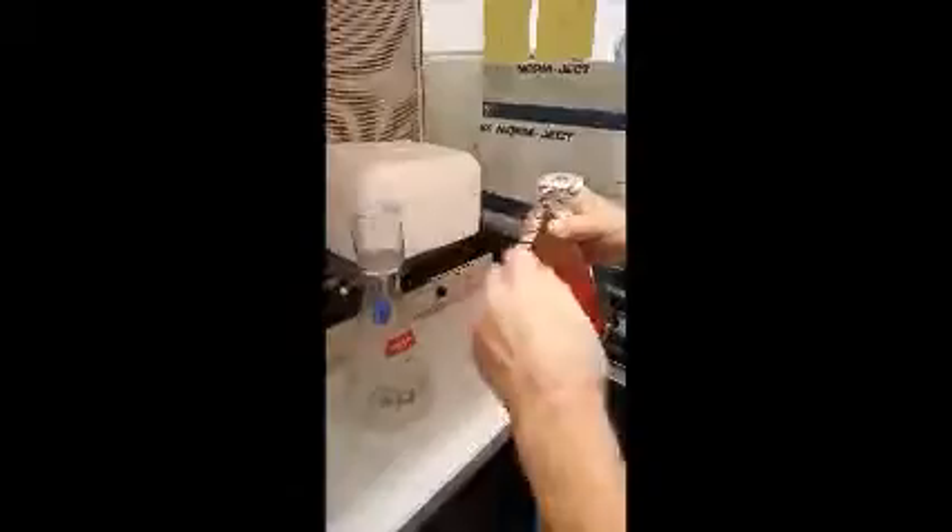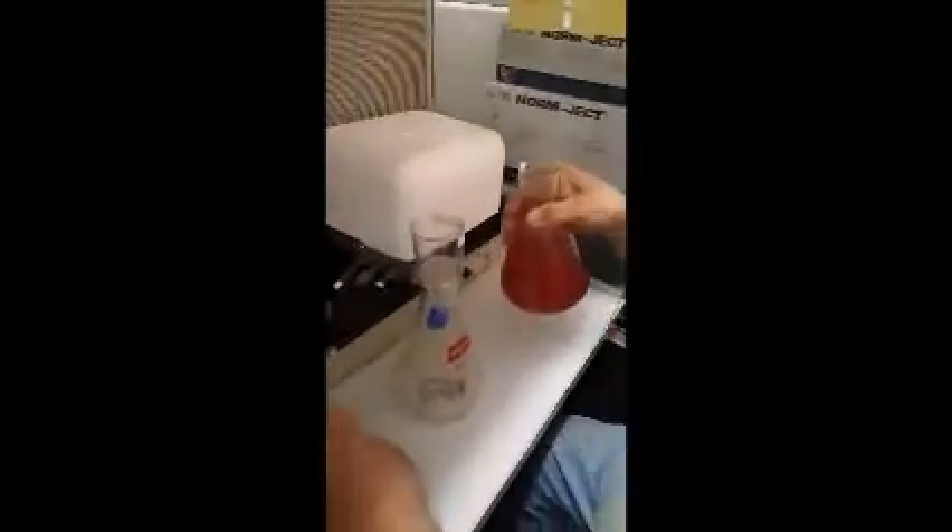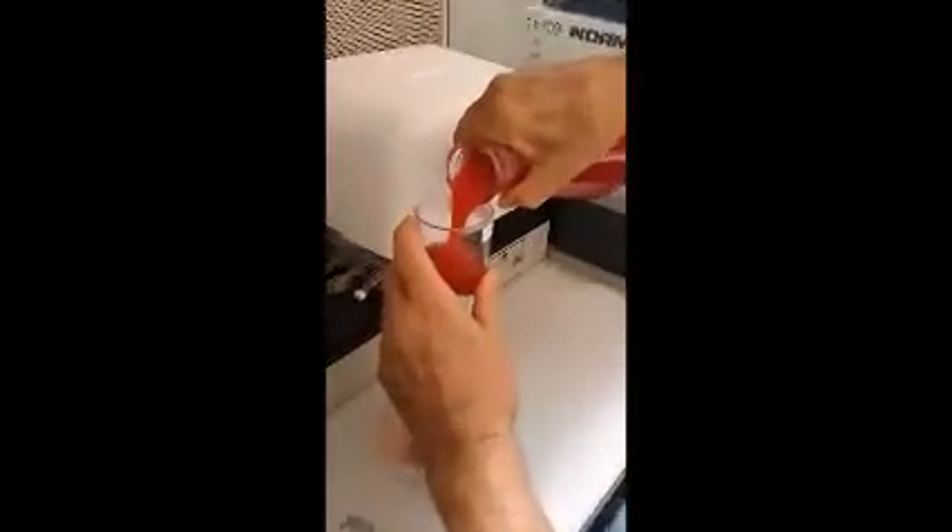During the aspiration, the technician must spin the needle to scrape the eggs off the sides of the follicles.